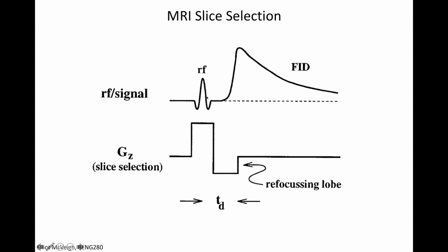We'll produce 64 megahertz RF inside an envelope that modulates like this, right? We'll then shut the Z gradient off. And what we now have is a 1 kilohertz wide slab of our sample when the gradient was on. When the gradient's off, now everything's at 1.5 T, but I still have this slab, whose frequency corresponds to a certain linear dimension in space.